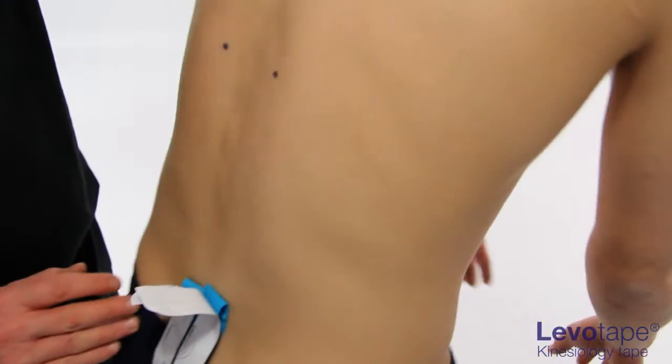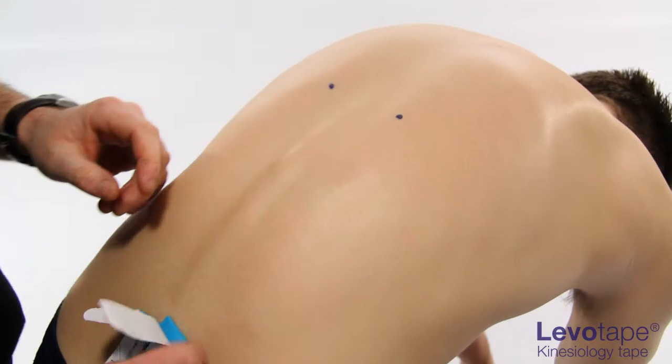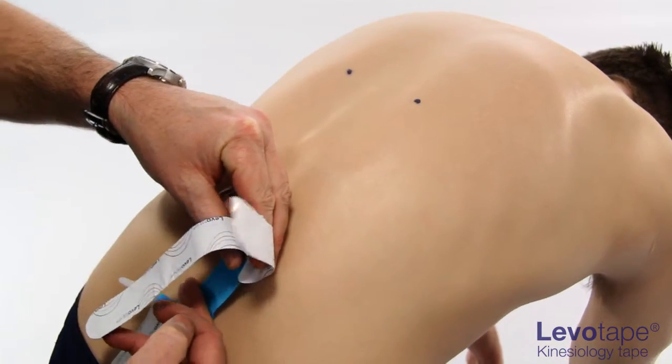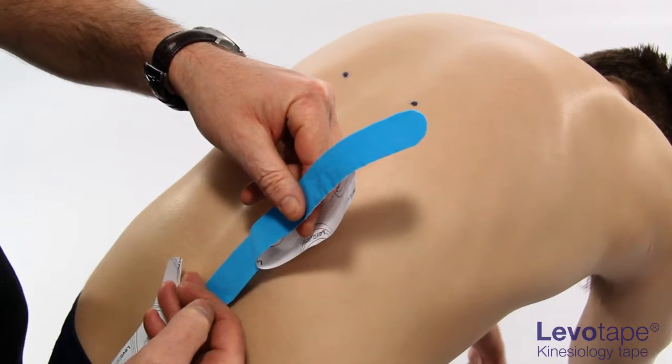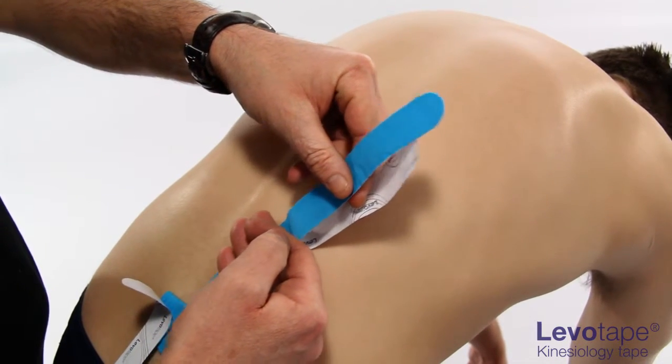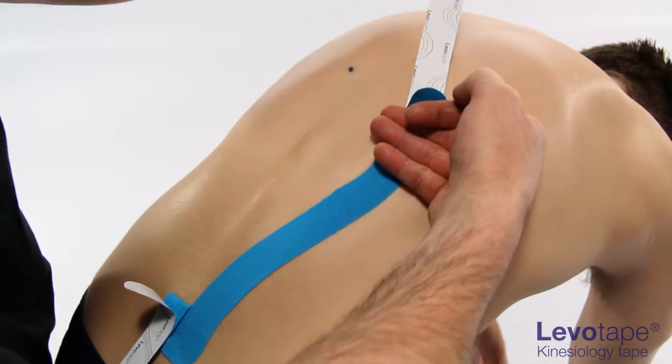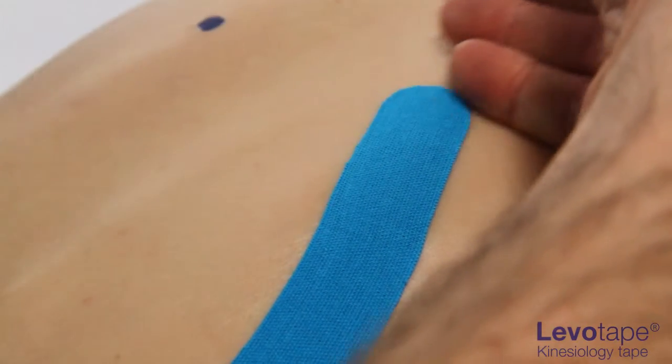Instruct the patient to bend into maximal achievable flexion with straightened knees, outstretched arms and hands pointing to the floor. Gradually lay down the first tail of the Y-strip, following the natural curve of the muscle belly with absolutely no tension.